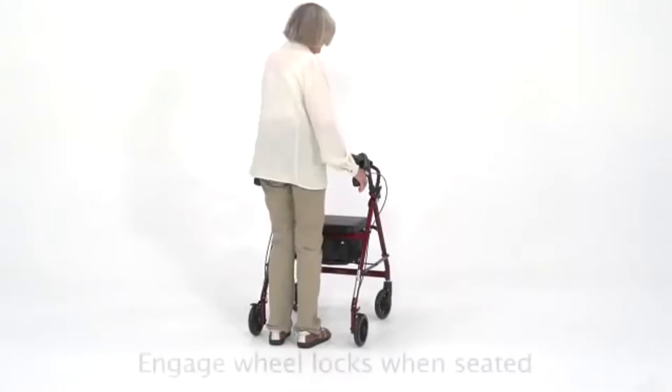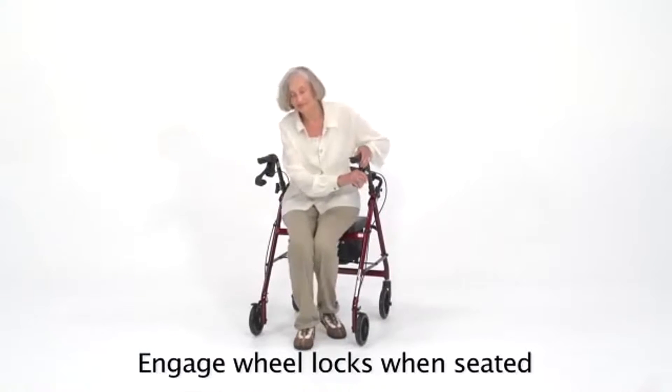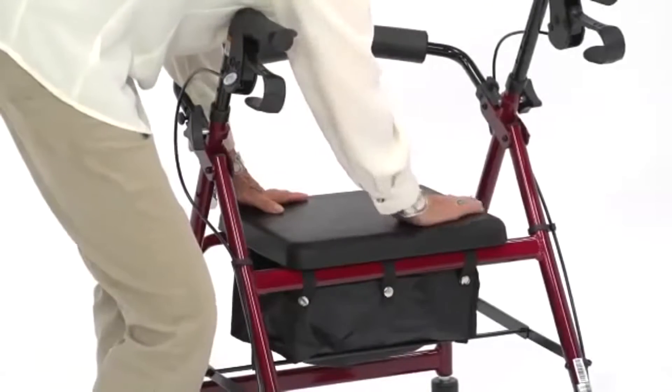The wide padded seat and backrest are not only soft and contoured for comfort, but they are also seamless and cut and split resistant to prevent rubbing and irritation. The strong polyurethane material is also long-lasting.